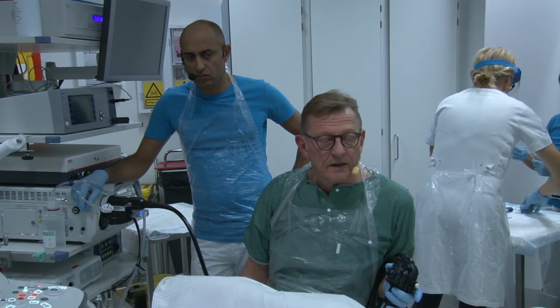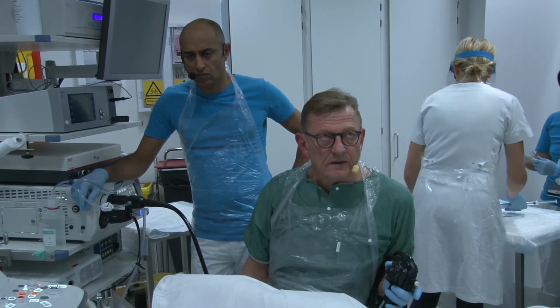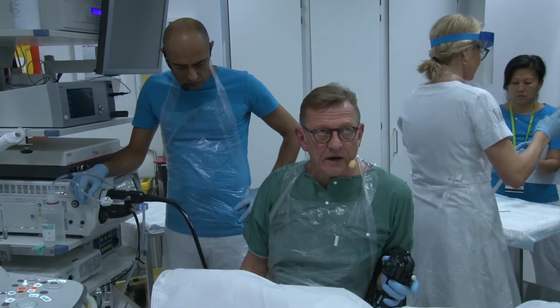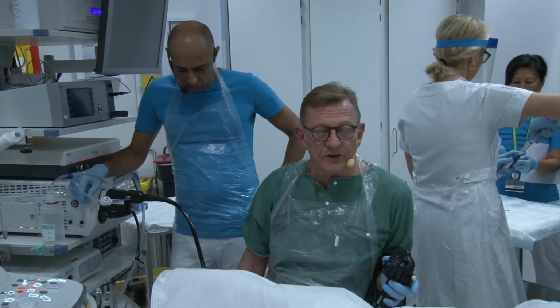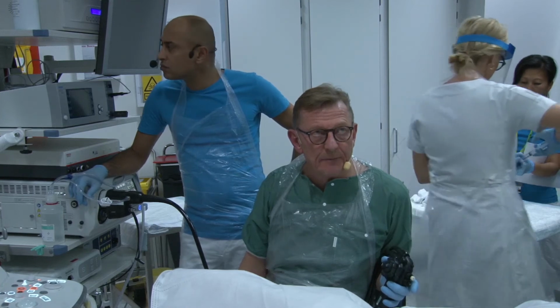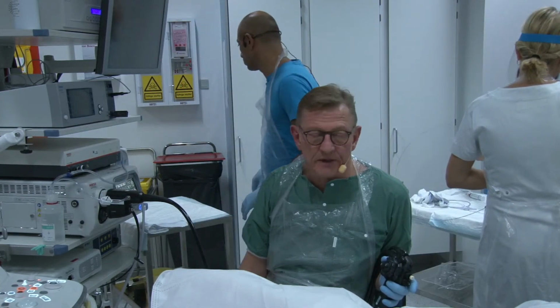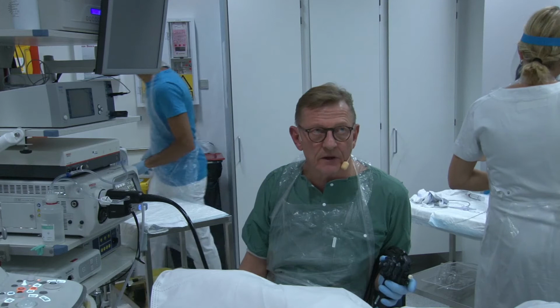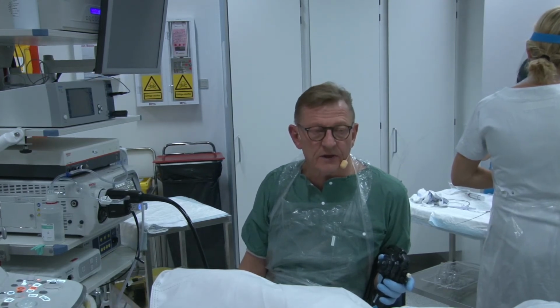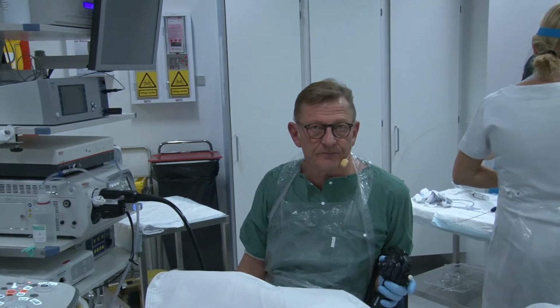If you could have a look first and then target your biopsy. Yes, exactly. Yeah, the idea is good. I doubt whether in smaller cysts there's time to do that. In bigger cysts, yes, it's a good option, but still scientific questions.